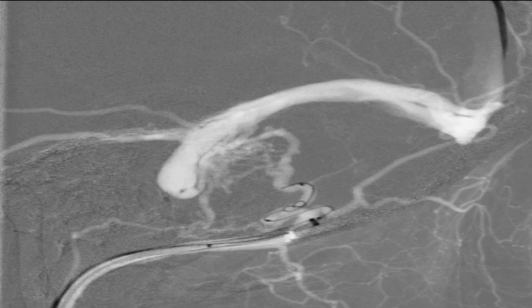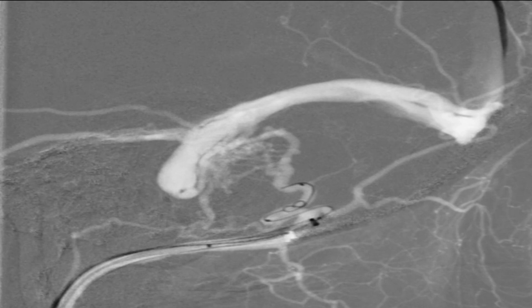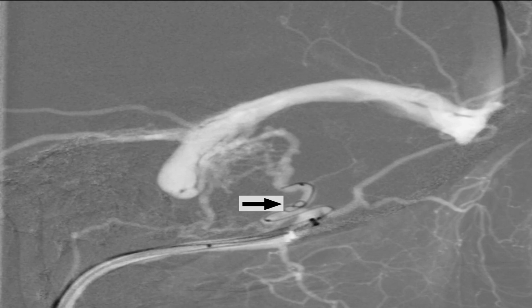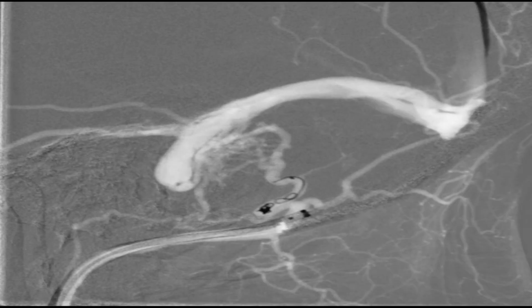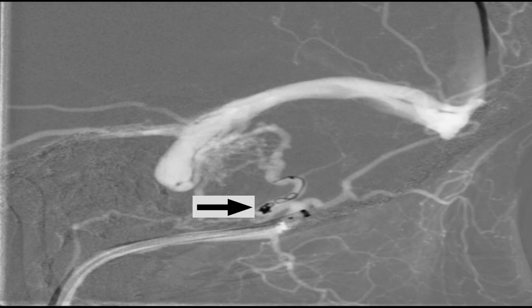And then we started deploying the coils through the Echelon 10 microcatheter to make a pressure cooker effect during injection of Onyx. The Onyx which will be injected will be delivered only distally without reflux into the proximal feeder vessels. This is the first coil deployed, marked with the arrow. This is the second coil deployed, marked with the arrow.